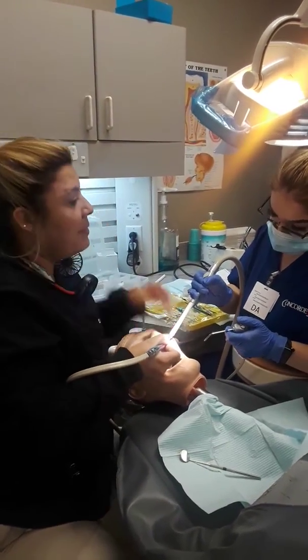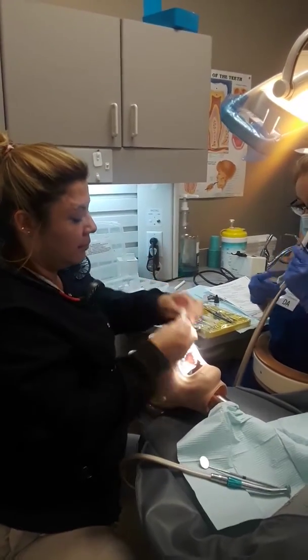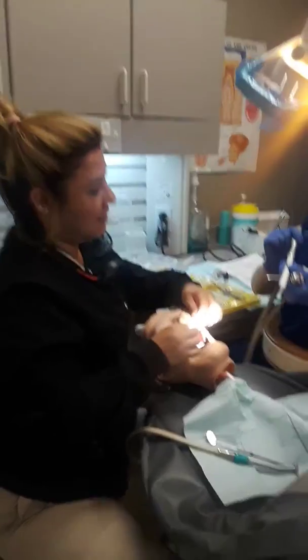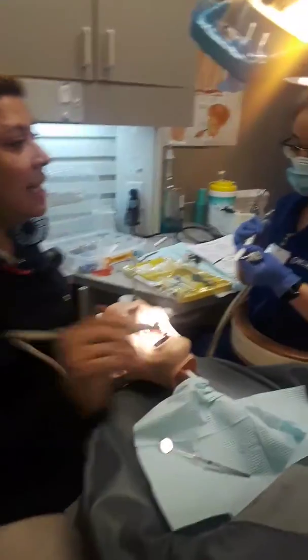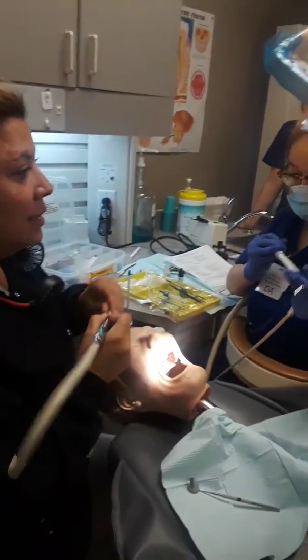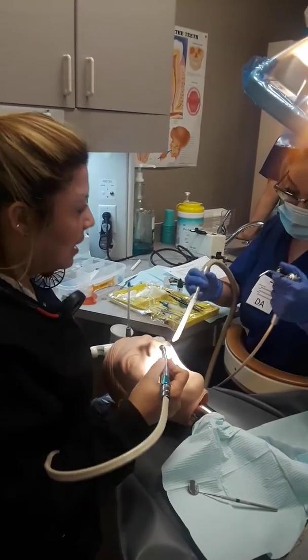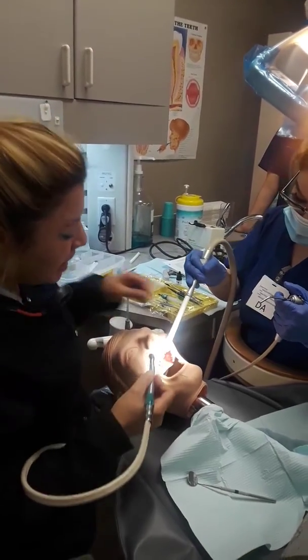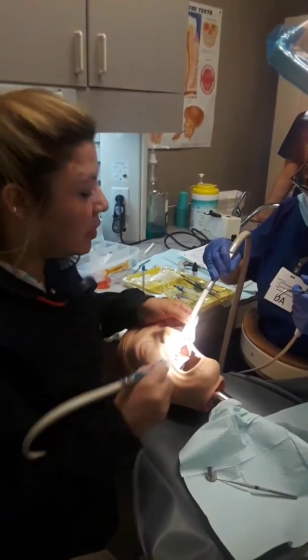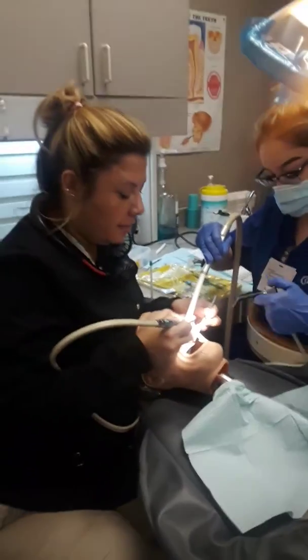We missed a step — pass cotton roll. Right before the high speed, place the cotton roll. It's easier for your suction so you're not stabbing that mucogingival tissue.